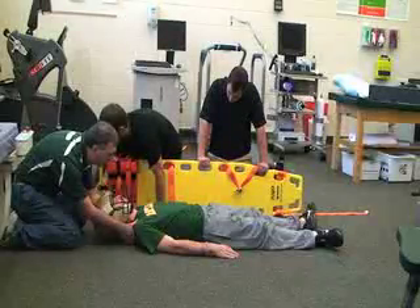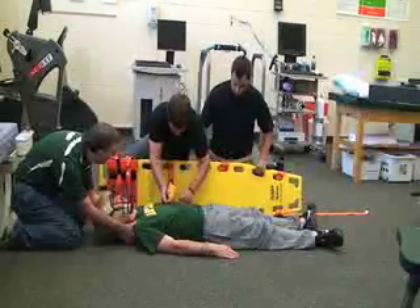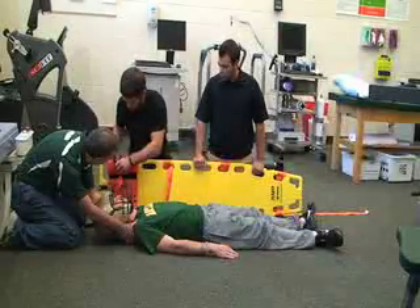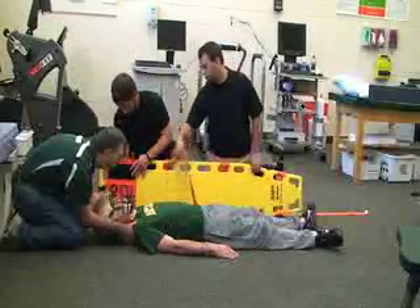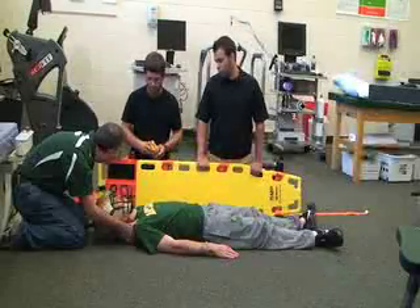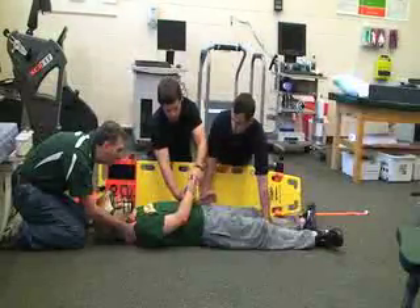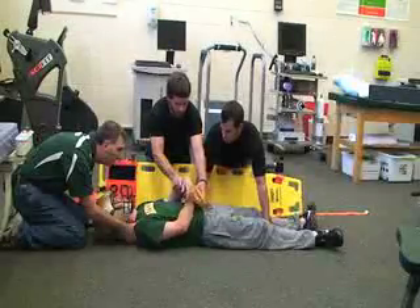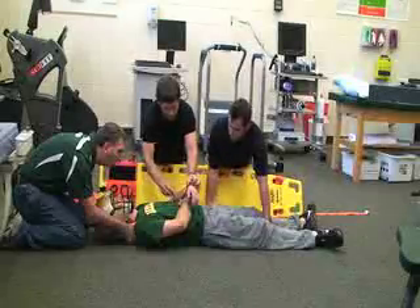We'll keep the face mask on for this one. Our two rescuers have the backboard here, and I'm going to ask you to go ahead and take the head pieces off the backboard — that's Velcroed on, the yellow one — and then we're going to keep those close by, rescuer two. We're going to go ahead and put the handy device on, the little orange one. As we crisscross the hands, we're going to put those inside the U's, and then the piece of rubber is going to go around that to help hold the hands in there.